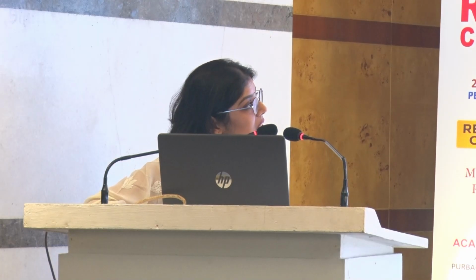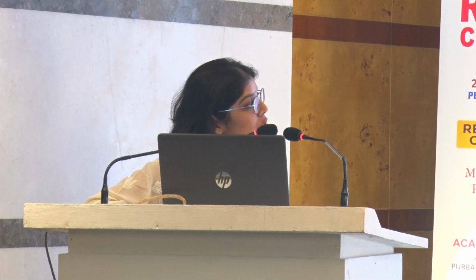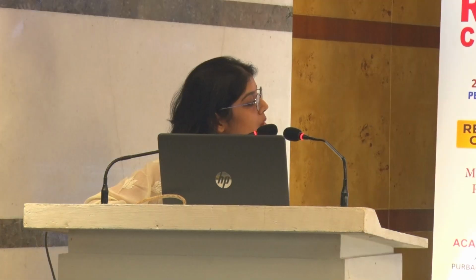Crystal-induced arthritis: a 65-year-old male with recurrent attacks of pain and swelling of the first MTP joint. We can see over here a very clear DC sign. So we actually scanned other joints. This was the knee joint, which also had a DC sign. His main symptom was in the foot.